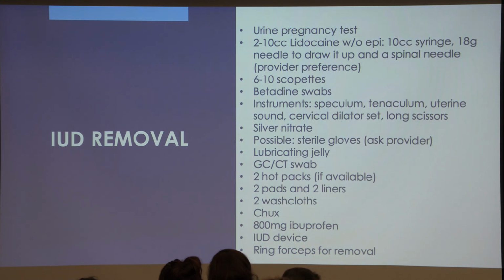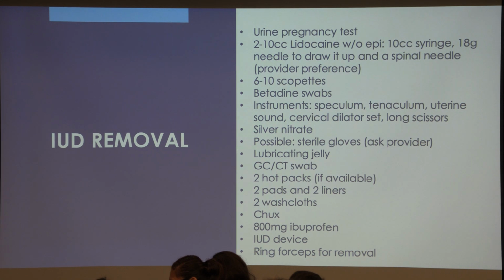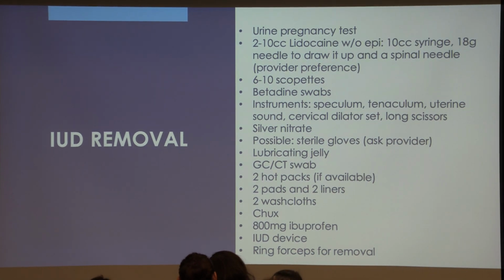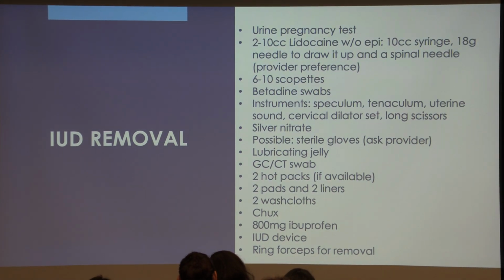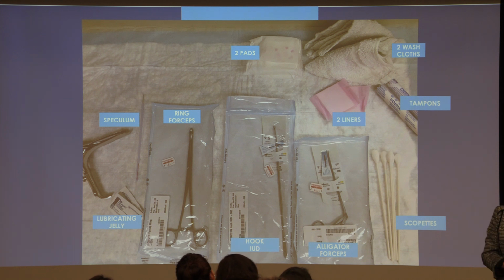IUD removal. Really for IUD removal, as noted there, this is IUD insertion at the bottom. Last thing, kind of just removal, is the ring forceps. However, let me show you just a few extra tools that we need. Again, your speculum is needed.